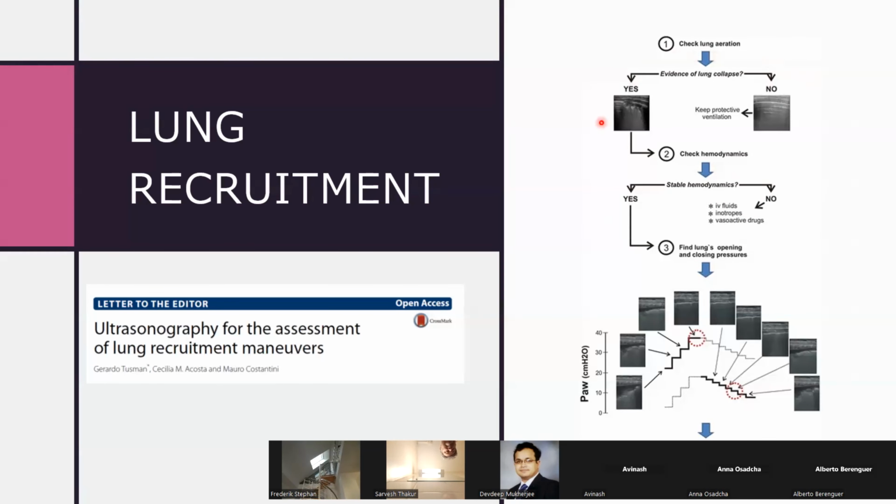On the other hand, in a baby with quite significant chronic lung disease, who's got really stiff lung, when I've had to jump up by PEEP of about 3 to 4, I may well need to support that right ventricle. If I've got underlying pulmonary hypertension, I might need, from my perspective, to recruit lung first, but it might be that I've achieved as much recruitment as I can, and this may be a baby who needs nitric oxide, because actually I don't want to use more pressure.